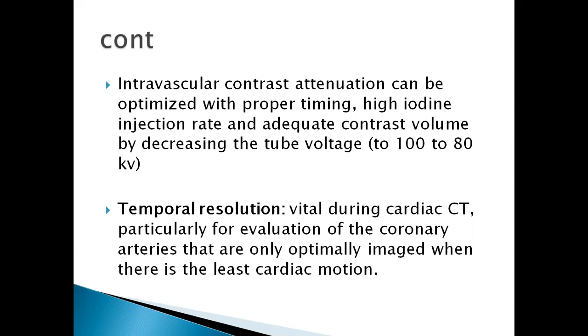A few articles do talk about reducing the kV to 100 or 80 kV, but I must mention that at the station where I'm at, we do not manipulate this kV, but it's out there in the literature for those who would want to read more about it.